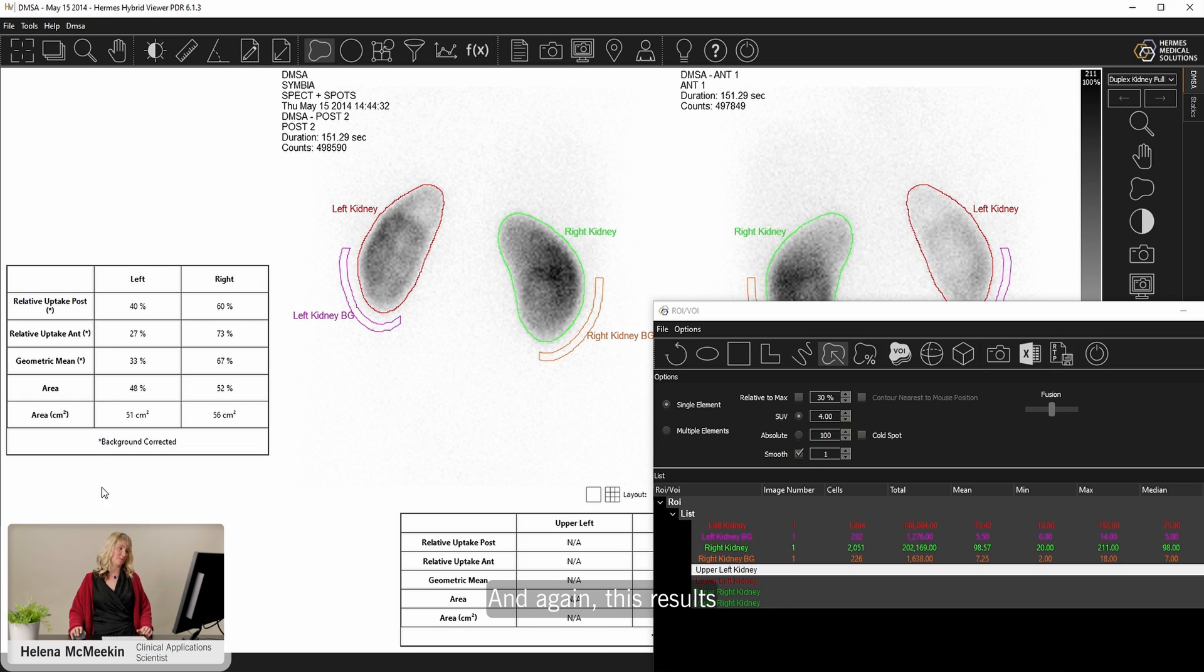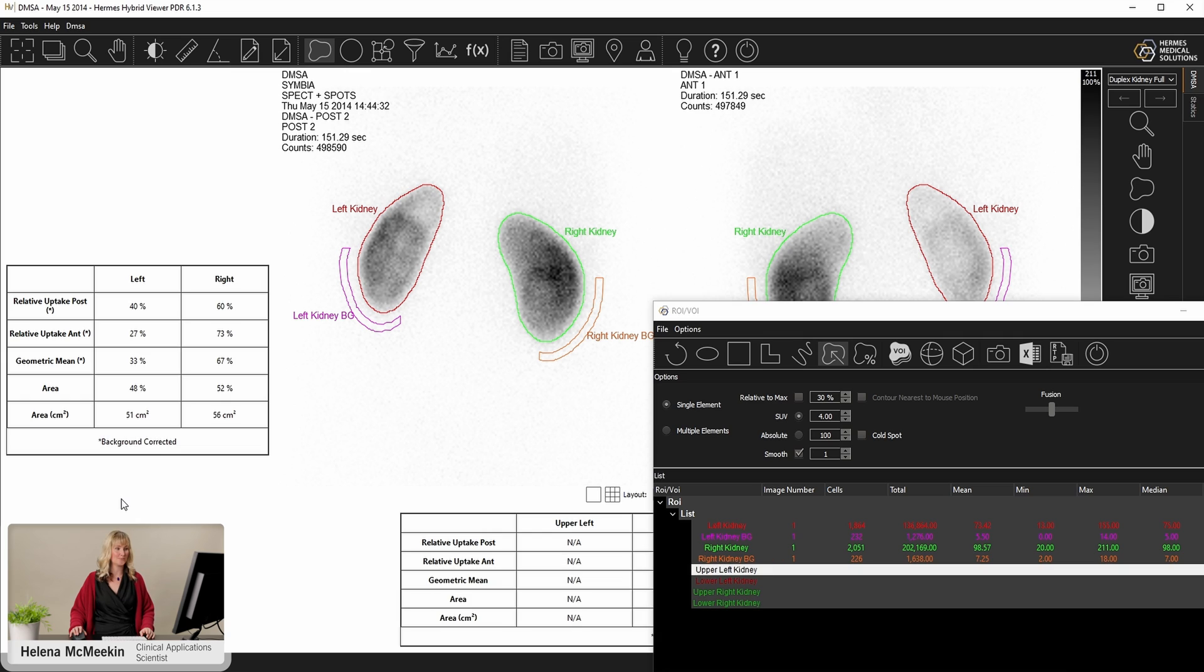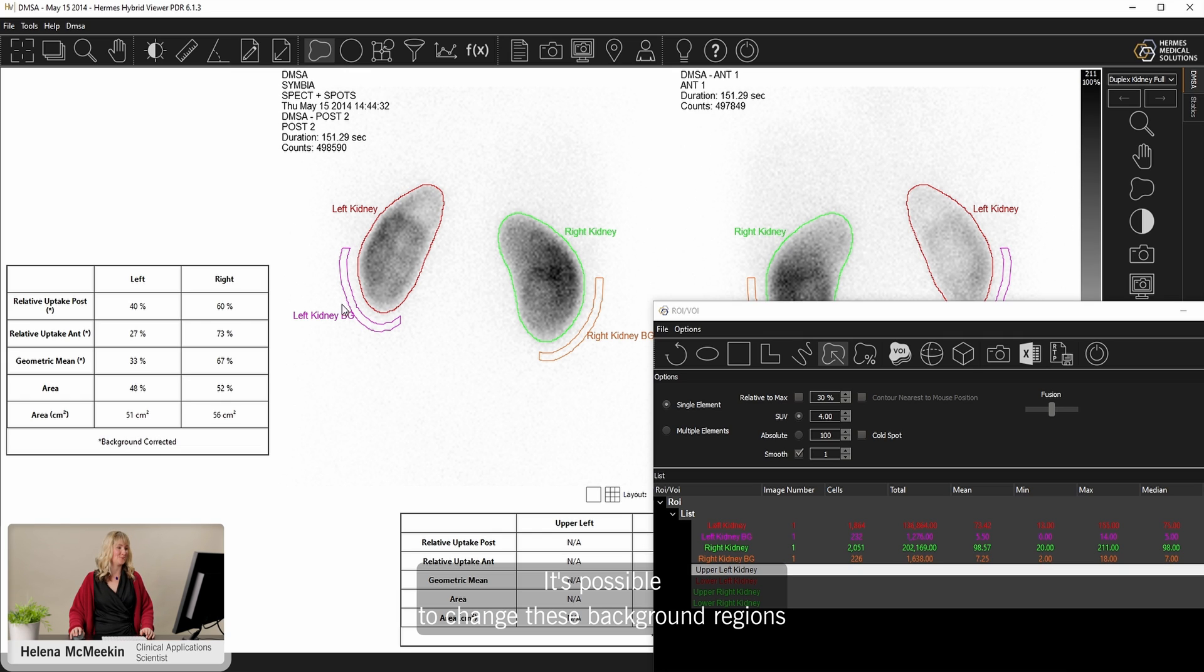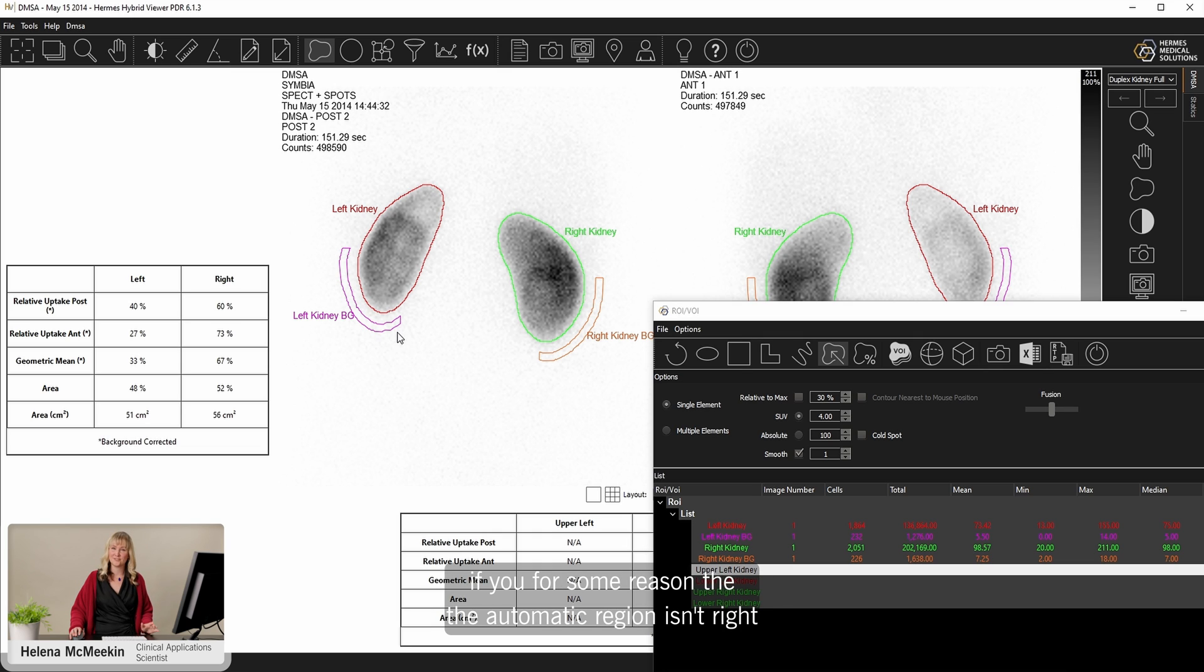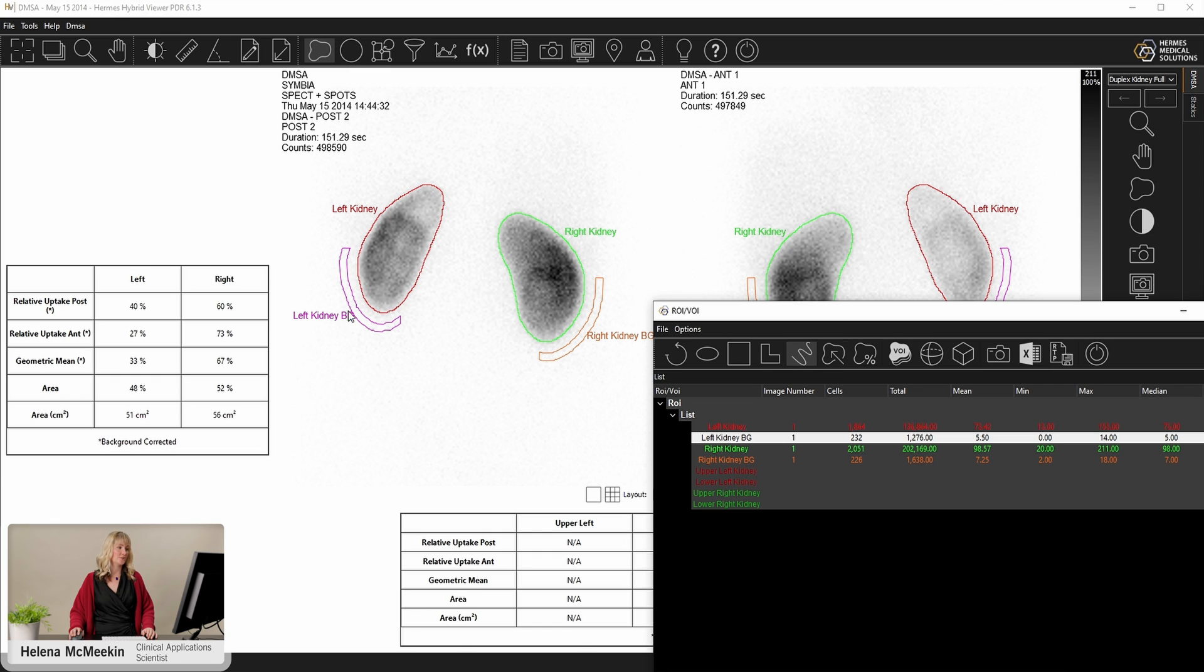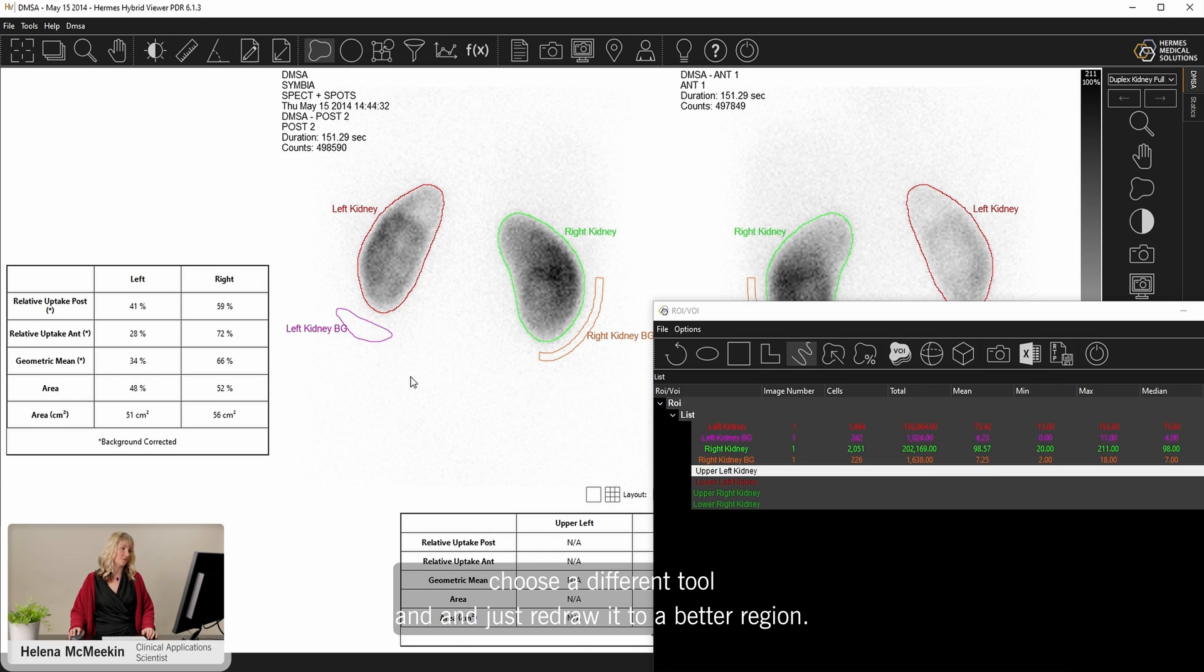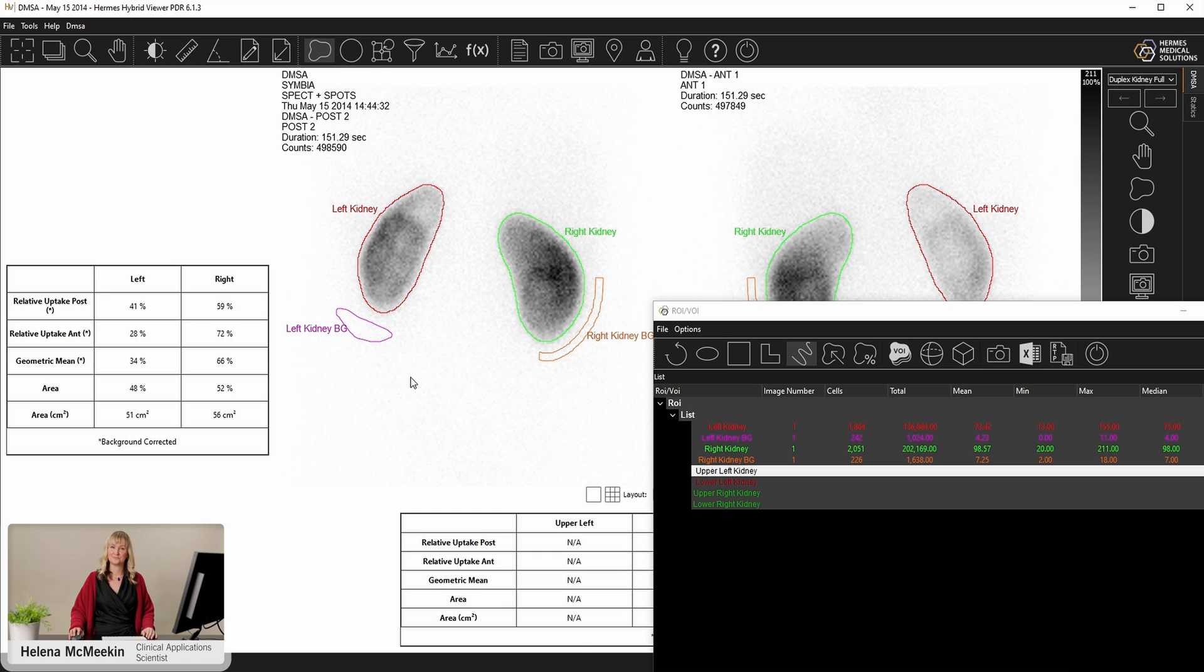So uptake for left and right as a percentage and geometric mean. And again, this results table is totally configurable to show only what you wish to see. If we need to, it's possible to change these background regions. If for some reason the automatic region isn't right, it's very easy to just select the one that you want to change, choose a different tool and just redraw it to a better region.